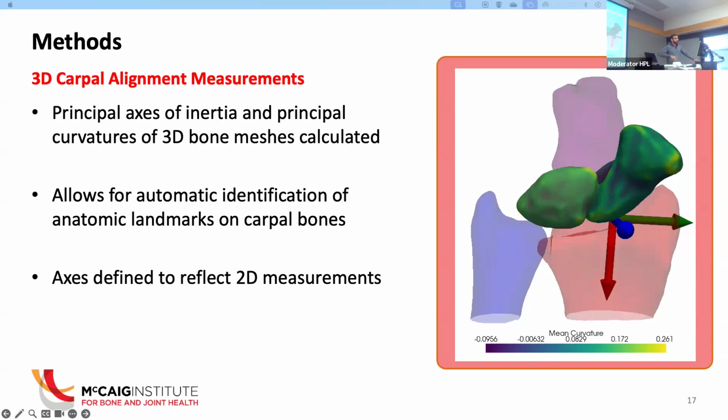Piggybacking on that last question, was there increased motion artifact in some of the injured folks? Are you able to quantify that at all? I wasn't able to quantify it, but from the amount of manual measurements, I'd say it was about the same across both groups. In the load bearing, it was a bit more of moving your forearms a little bit, and that would affect how I measure the radius. So it did require a bit of manual adjustment of the segmentation, but it was pretty consistent across both groups.